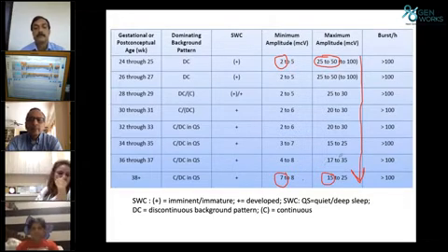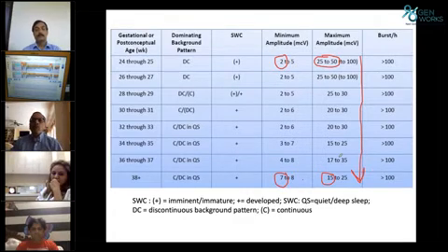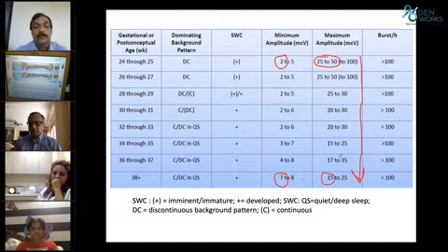So one thing you understood: the minimum has increased, which means basic electrical activity has increased. The maximum burst has started coming down because it is organized. One thing you understood now as it matures. Suppose there is a pathology. What happens?